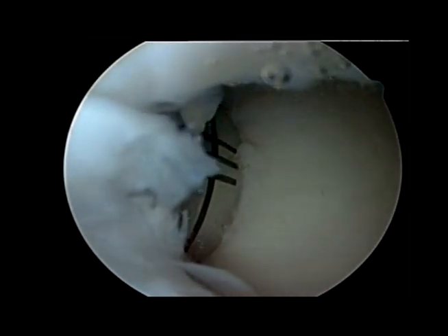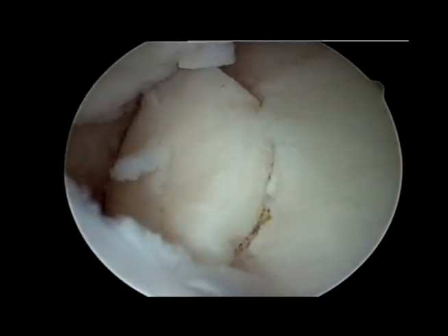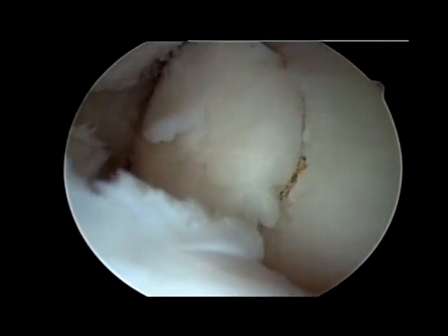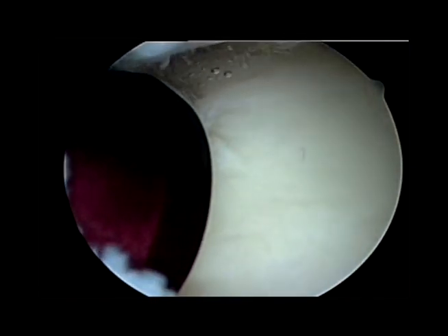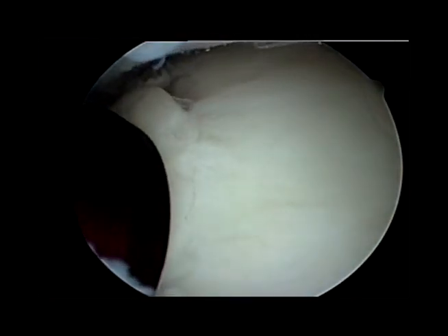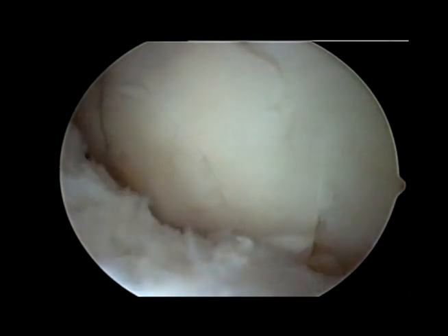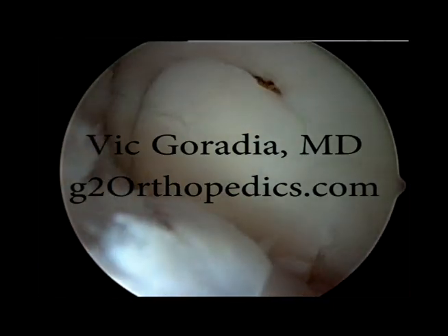Here we can see some of the cartilage that's proud. We're going to tamp this down so that it matches up with the surrounding cartilage. Here's the tamp that we're using. We're going to get that as flush as possible. Here we see the cartilage as flush as possible with the surrounding cartilage, and this fills the defect.